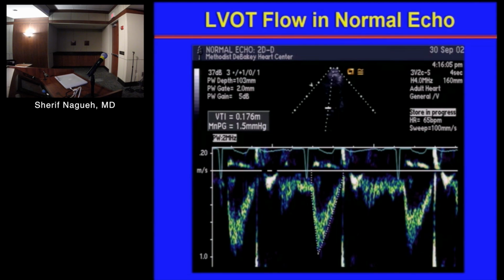Any volunteer? You would not include that one because it's happening in late diastole, before the QRS complex. That's blood flow that has propagated within the ventricle and is making its way to the LV outflow tract. An indirect evidence of a vortical flow, or a flow due to a vortex, that we haven't shown you the actual vortex, but this is what that is.